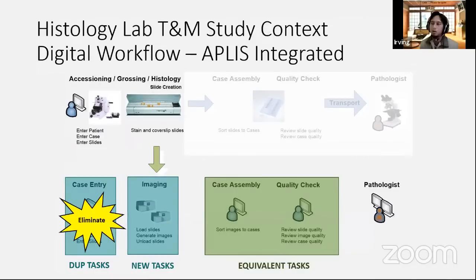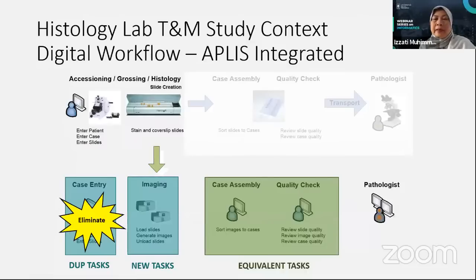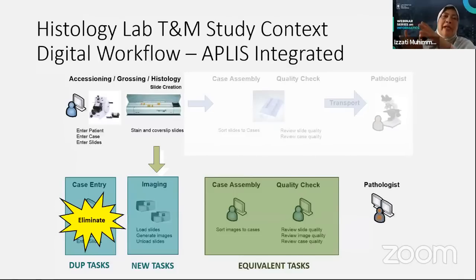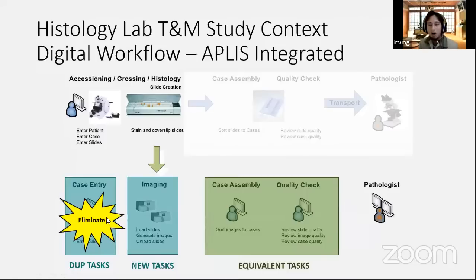I see, so you mean there should be an integrated imaging device. Yes, one that can take many slides, put them in the system and scan automatically. That is not available in Indonesia, so we propose mounting the CCD camera on the microscope that is available and used in primary care. I see. Okay, next question.